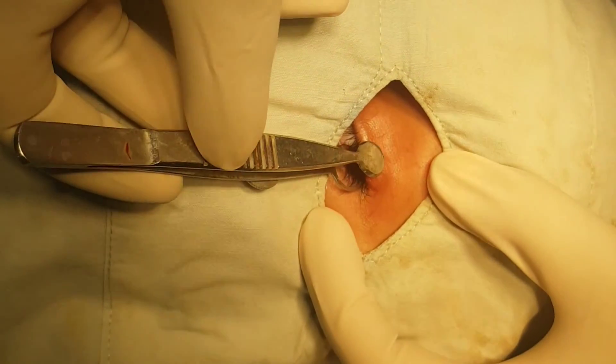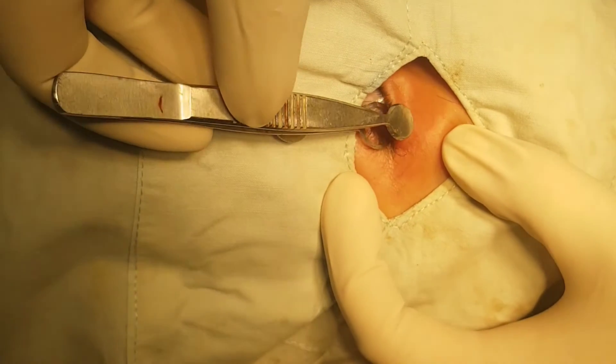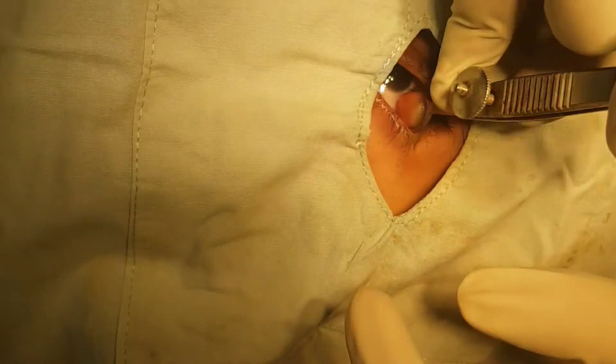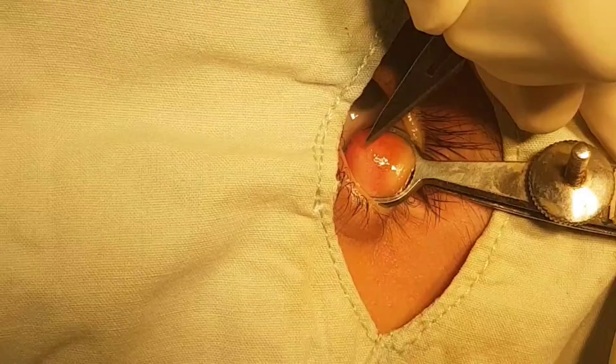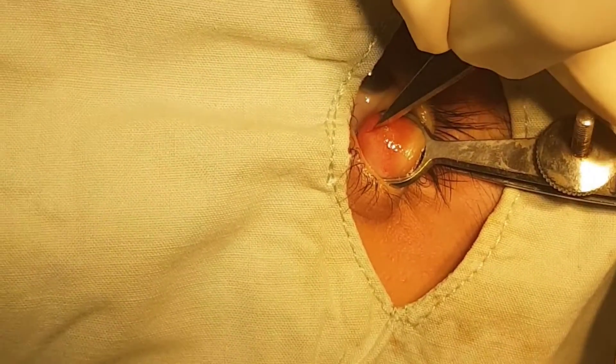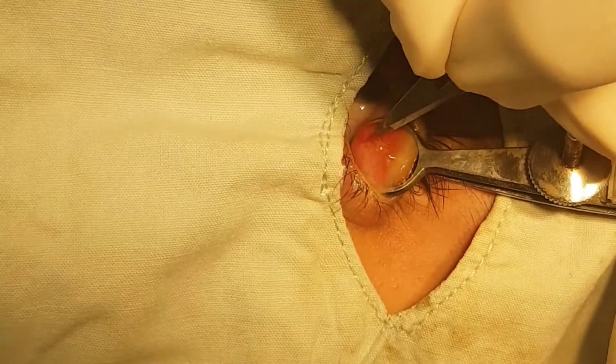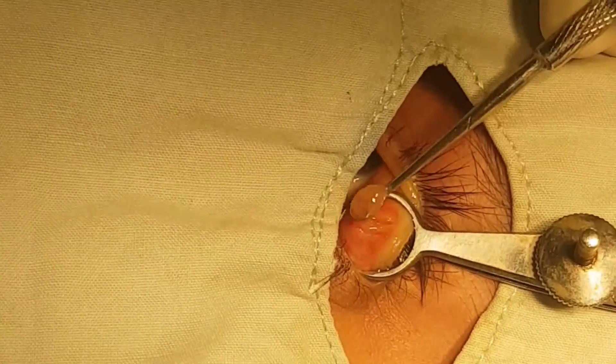Let's see another case. This is again an upper lid chalazion. This patient was a child, so the case was done under GA. The procedure is the same — you clean and drape the surgical area, then take a chalazion clamp, hold the chalazion, evert the lid and tighten the clamp. A vertical incision is made over the chalazion. A chalazion curette is used to scoop out the contents, then the clamp is loosened and removed and the eye is bandaged after putting an antibiotic ointment.